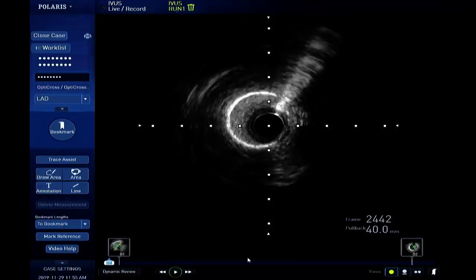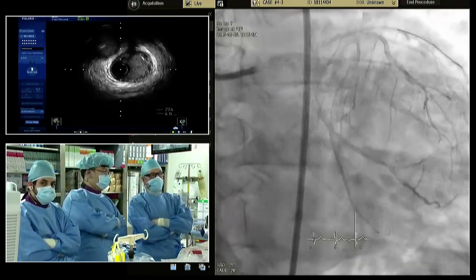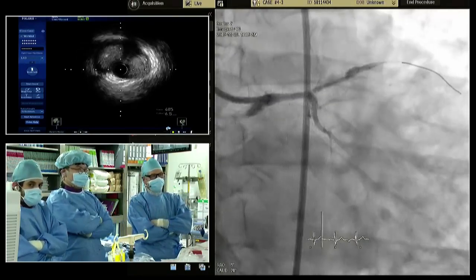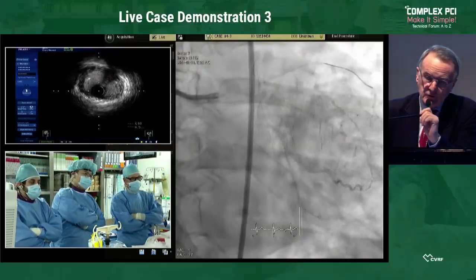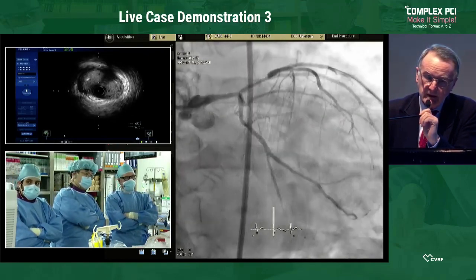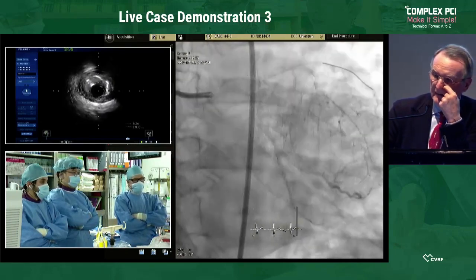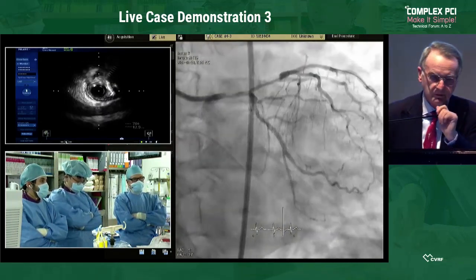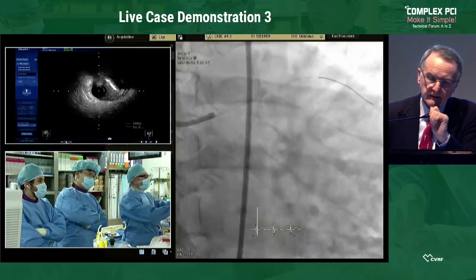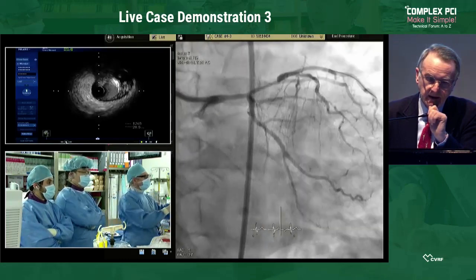Okay, so what do you suggest? Antonio. I think I will go with one stent, almost for sure. We really try to minimize stenting of the circumflex. There is a little bit of mismatch between the left main and the LAD, but still I believe with a metal stent you can overcome it. Of course, you utilize different balloons. That's my strategy. And in the LAD diagonal, can we see again the cranial view?